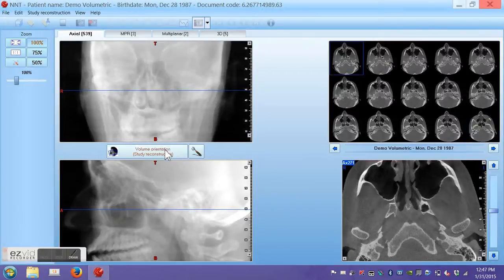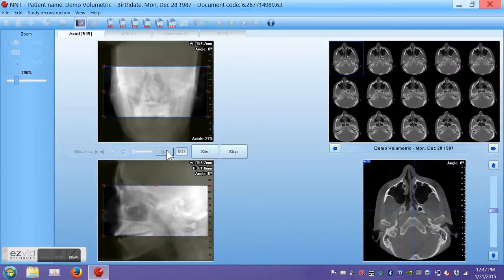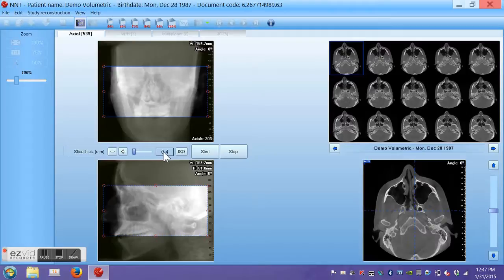Click on Volume Orientation. Click on ISO and the plus sign to set your slice thickness at 0.4. I like to begin with the orientation looking at the axial slice.